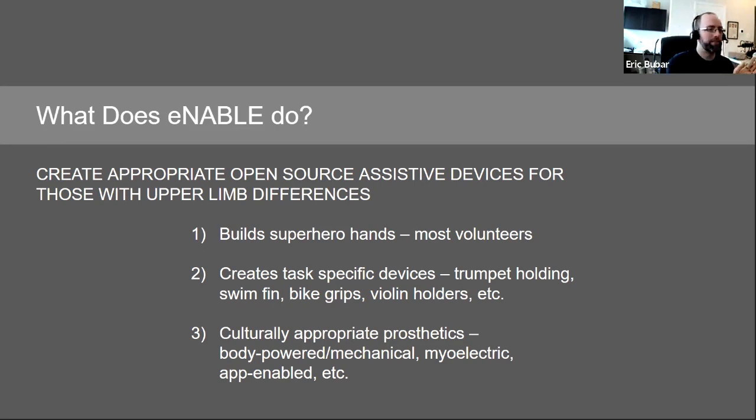So whereas normally the plastic that most Enable devices use is quite hard, like a Lego brick, this is like a soft Lego brick. So this is actually squishy. It's actually bendy. It's a material called Ninja Flex. And we'll show you more about Ninja Flex in a moment.